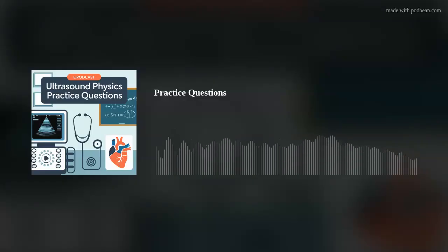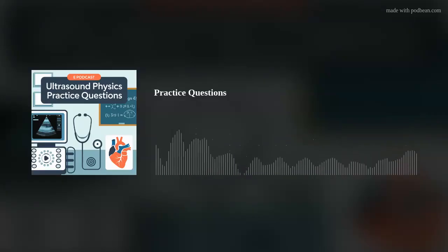It's like turning down the background noise so you can hear the conversation better. So it's like cleaning up the image by getting rid of the clutter. Exactly. Weak echo rejection helps improve the contrast and make those subtle structures that might be hiding behind all those weak echoes easier to see. That's a great tool to have in your arsenal.